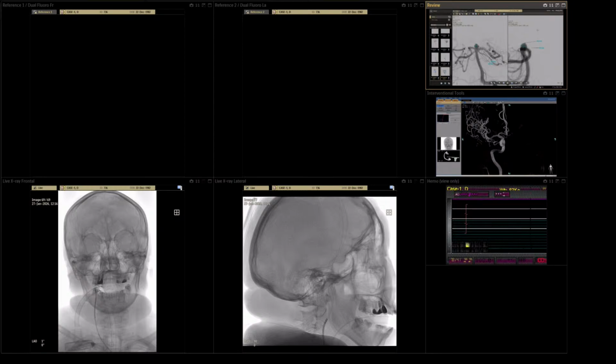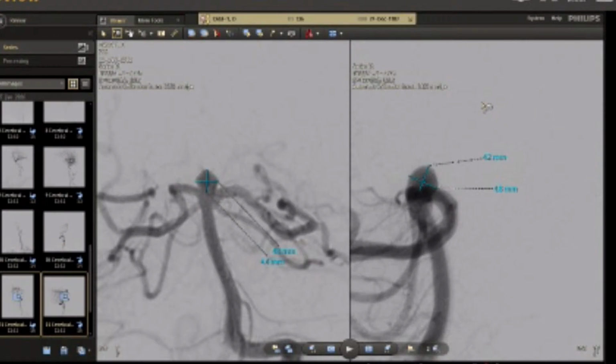Our colleagues since morning had a patient with a brain AVM, and now a patient with multiple aneurysms. The first aneurysm, the ruptured one, is located in the MCA territory. I will show it a little bit later. MCA ruptured and the basilar bifurcation non-ruptured.